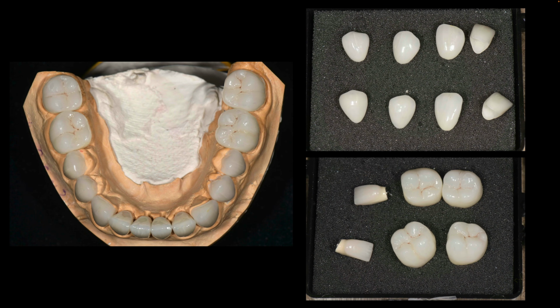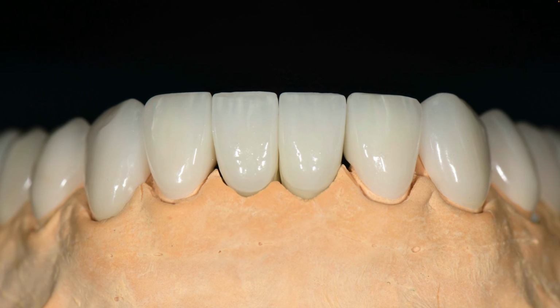And on the lower, we did metal ceramic on the 2 Nobel 1s. We felt that was the best way to go because of the way the margins are. And then we did feldspathic again on the anterior. And then I believe these are, again, Emax. And then these are zirconia in the very back, posterior on the molars. Full contour zirconia, full contour Emax, I believe, and then feldspathic at the front with metal ceramic. So another mixed bag of different materials.